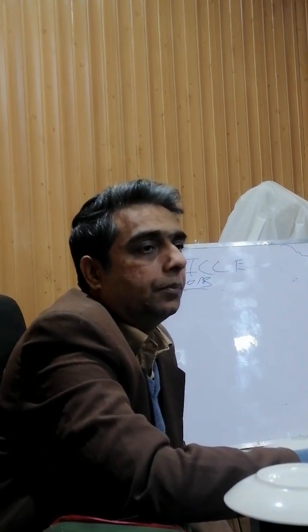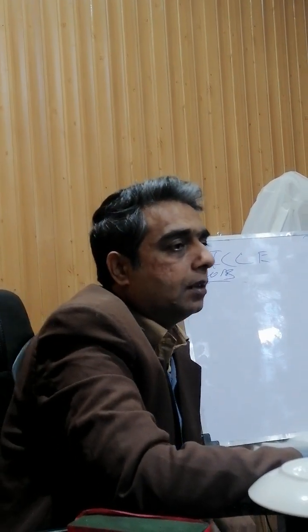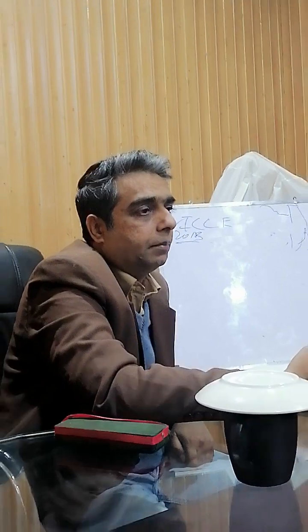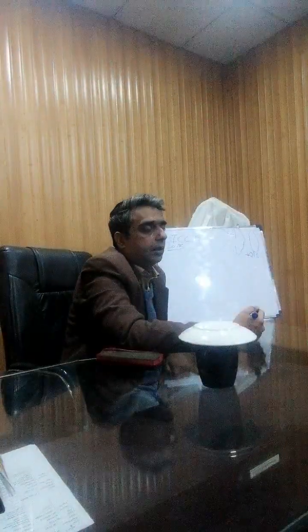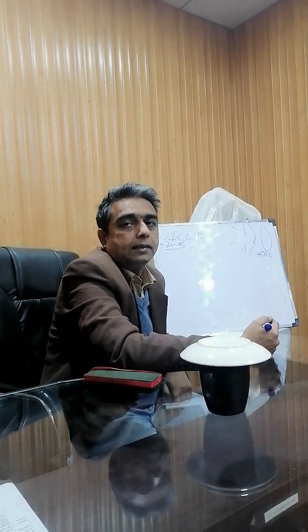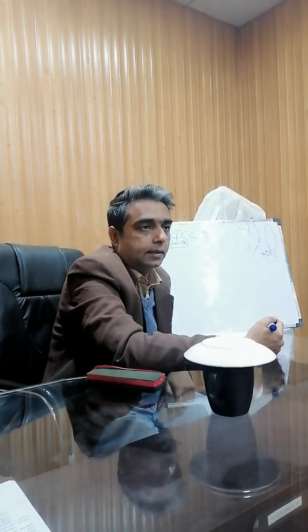So phacoemulsification, which is now, we have a surgery which is even better than phacoemulsification, done by laser. This is called femtosecond cataract surgery. That is really a laser surgery.